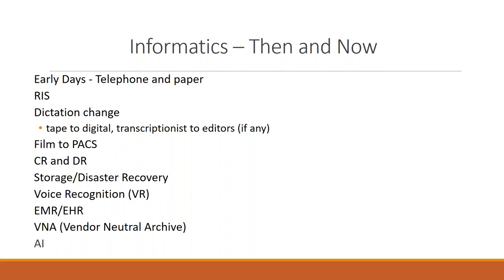Back in the early days of the then and now, we had telephone and paper. We went to a RIS. We went through a major dictation change from tape to digital, and from transcriptionists to editors, if you even have any of those at all. For embracing technology, I think that was probably one of the more difficult ones I went through in my career: getting doctors to go from a transcriptionist typing what they dictated into some sort of tape mechanism to being their own editors. But the speed of having a template and a proper voice recognition system well outweighs that loss. It just took a little time for people to embrace it.